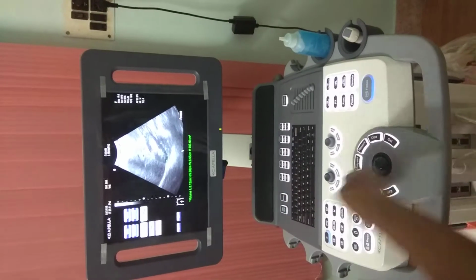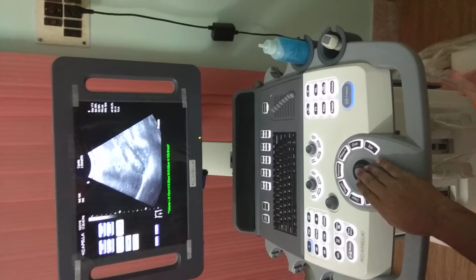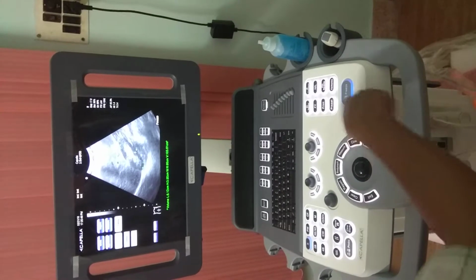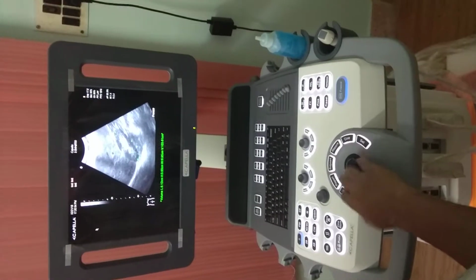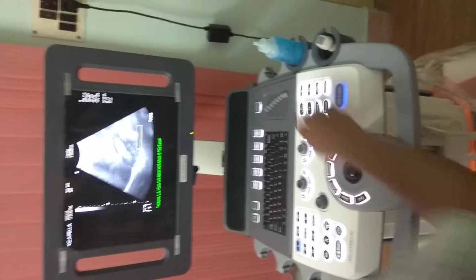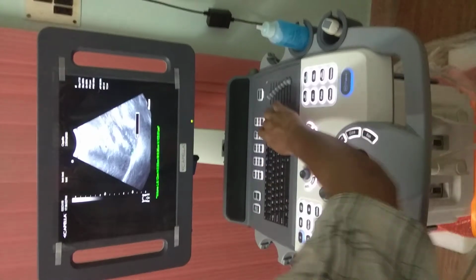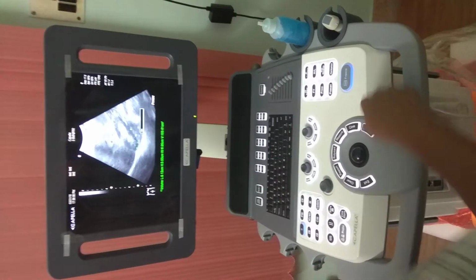And now if we want to give a notation, what we can do, we can just press this comment button. We can take this cursor here, press comment button. Okay, we just have to exit from this place. Nice. Now we press close. Now we have to input some comments, annotations. We press comment. See the box appears here. You can place right kidney and then we press set.